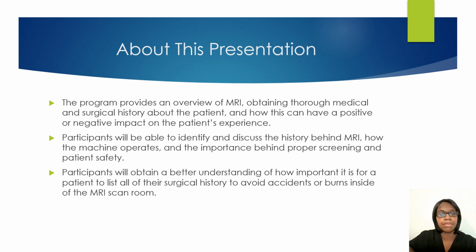And we are also going to have a better understanding of how important it is to ask the patient about their surgical history to avoid accidents or burns whenever they are inside of the MRI scan room.